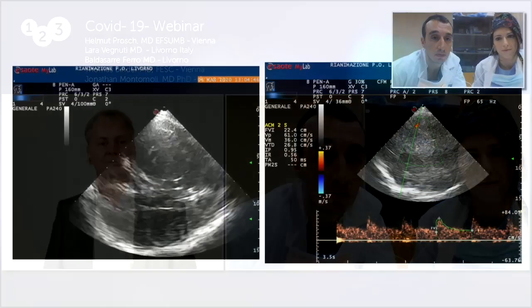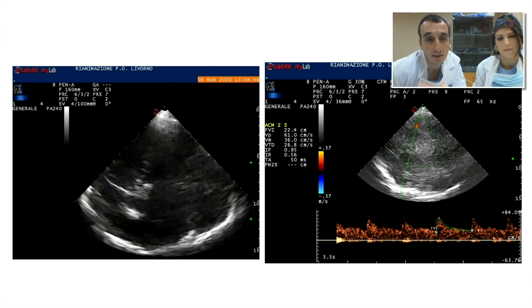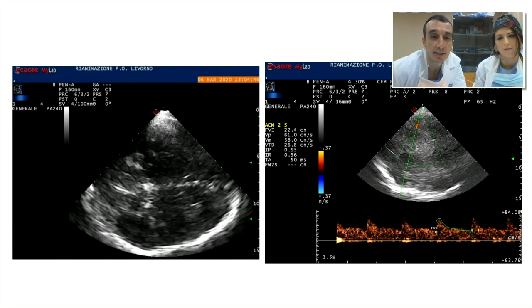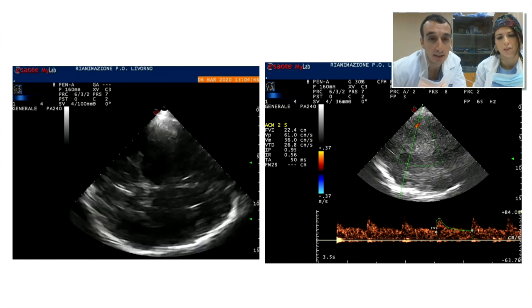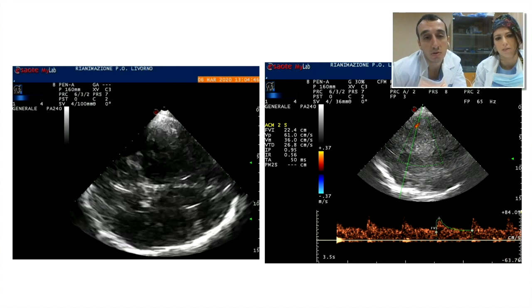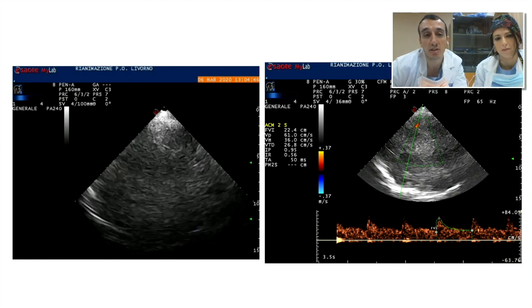Yeah, I guess there's one more thing that you wanted to mention about the role of ultrasound, right? Yeah, because when we had a patient in coma after COVID infection, and you have to do a CT scan of the brain in this patient that is indicative of a stroke or other pathologies, it's very difficult. And when you have a good temporal window, you can use ultrasound to do a differential diagnosis of hemorrhage in the brain.